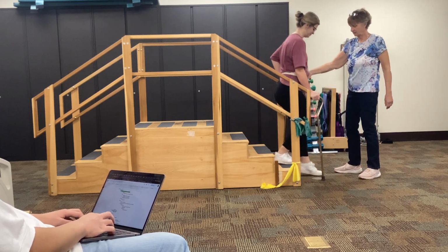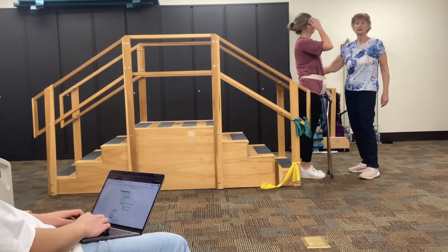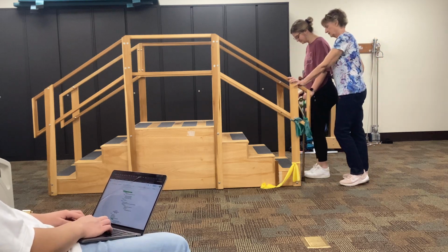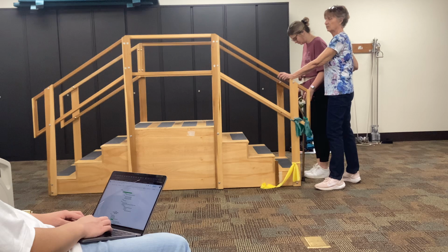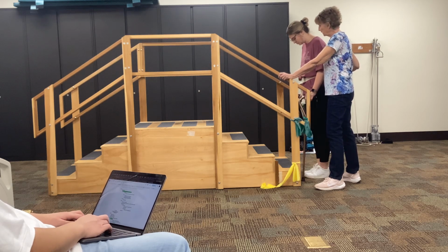Cane on the left, and then bring it up. Okay, so that would be one progression, and then a final progression, if she really got good, would be to do it just like she did while she was walking. So show me how you would do it if you did it the same way you were walking.